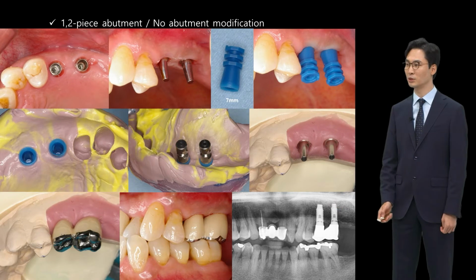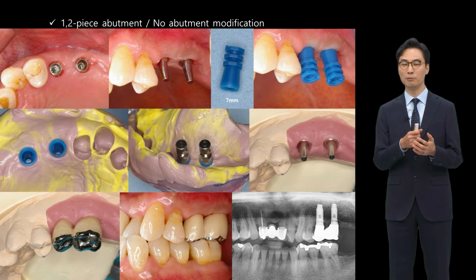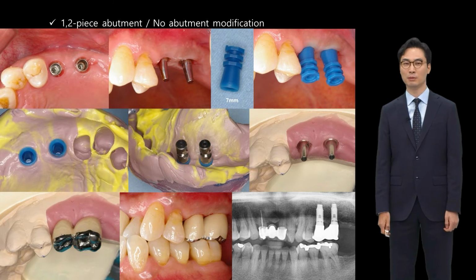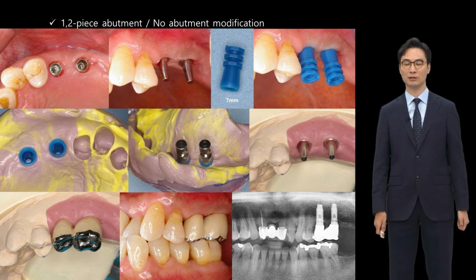When you connect the abutment analog, an OSSTEM model is made. A cement-type prosthesis has been fabricated and placed. If there is no modification on the abutment, be it one-piece or two-piece, we can take this kind of impression-taking method. However, there is a limitation in terms of indication.